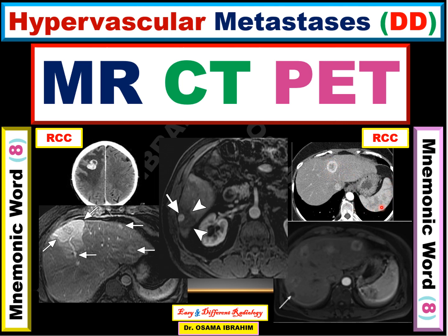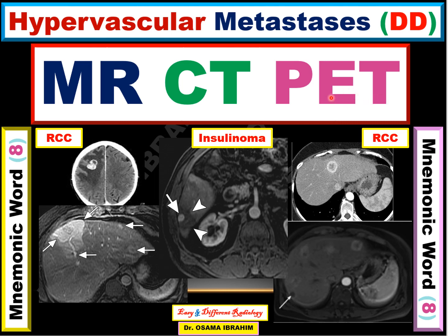If there are enhancing lesions in the arterial phase, they represent hypervascular lesions. If I know the primary — like renal cell carcinoma — then the likelihood is that this hypervascular metastasis originates from renal cell carcinoma, as one from MRCT. This is another hypervascular lesion in the liver. Assuming a known primary like insulinoma, the lesion in the liver is considered hypervascular metastasis, as insulinoma is one from the pancreatic neuroendocrine tumors.